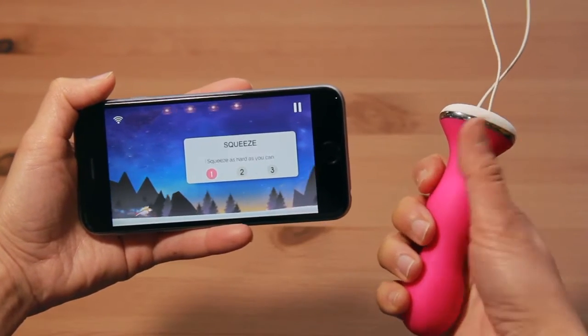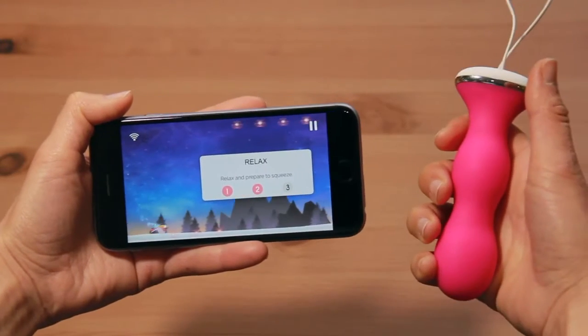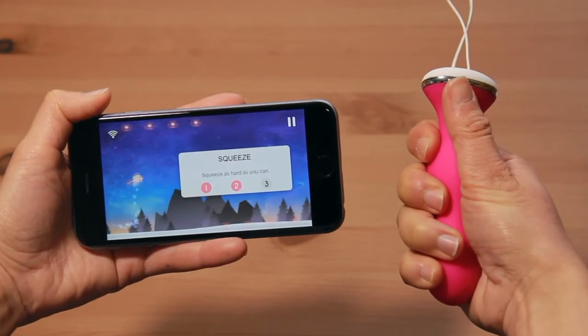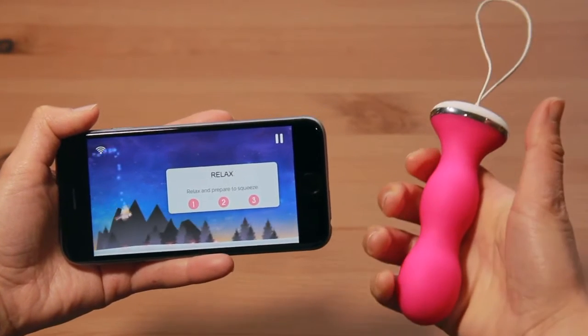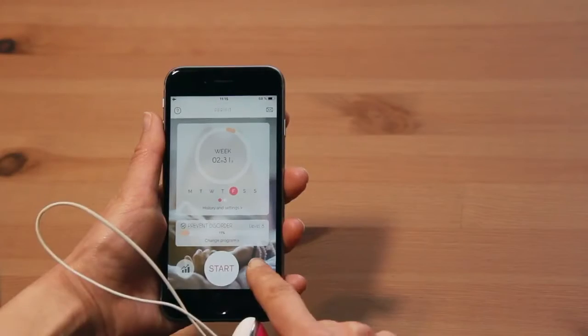Each game starts with a calibration step to make sure your Parafeet is compatible with your current strength level. You simply have to contract your perineum, then relax it three times in a row. At the end of the calibration step, you can see your strength level for that day.